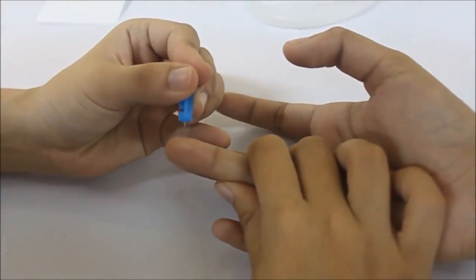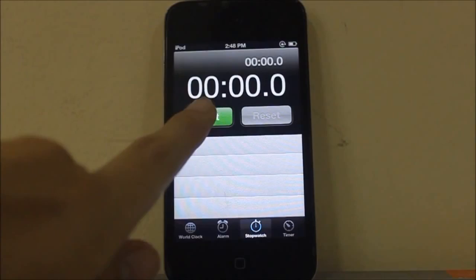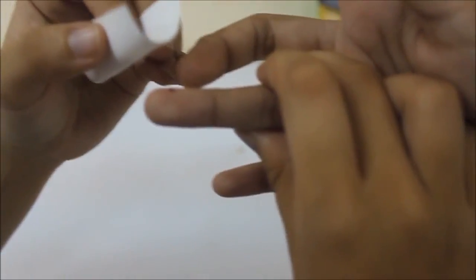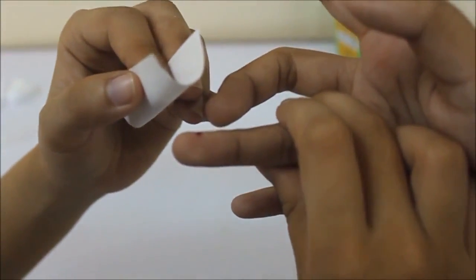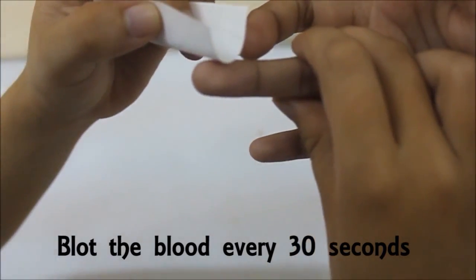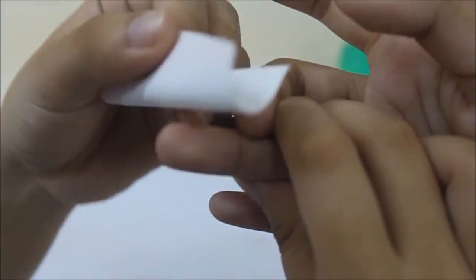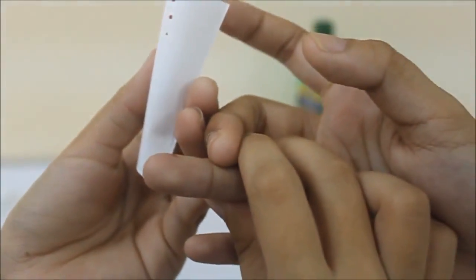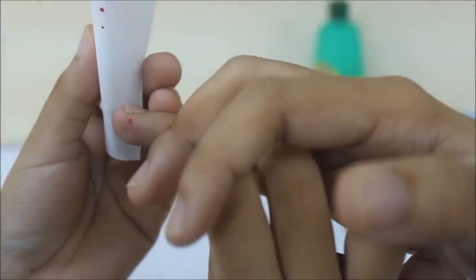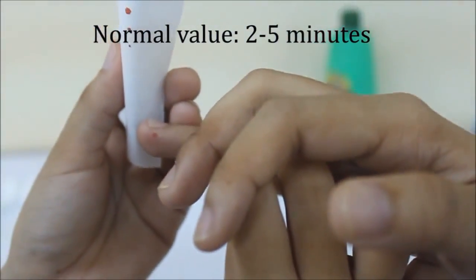Using a sterile blood lancet, puncture the finger about 2 to 3 millimeters deep and start the stopwatch. Do not wipe the first drop of blood. Blot the blood with the filter paper every 30 seconds by lightly touching the edge of the blood drop. Stop the watch when the blood is no longer absorbed into the filter paper. The normal value for the Duke's method is 2 to 5 minutes.